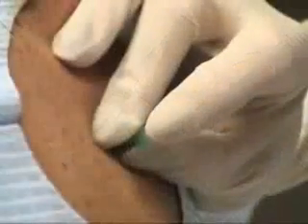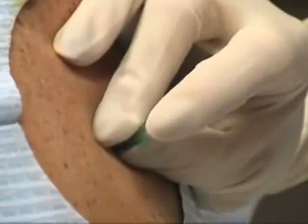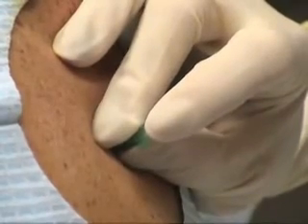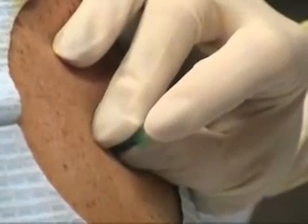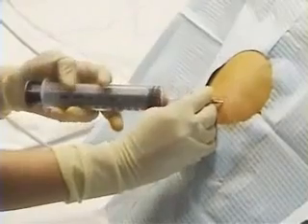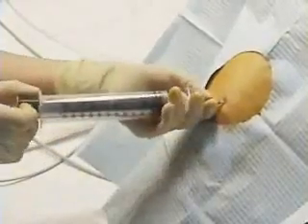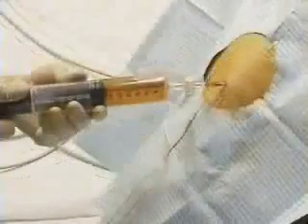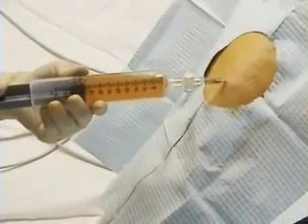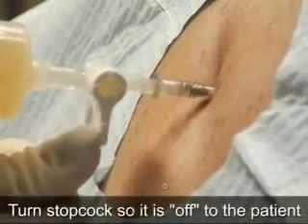The exposed hub of the catheter should be covered immediately with your finger to prevent the entry of air into the pleural space. Next, attach the three-way stopcock and large syringe to the catheter and continue to aspirate fluid. When the syringe is full, adjust the stopcock so that it is closed to the patient.